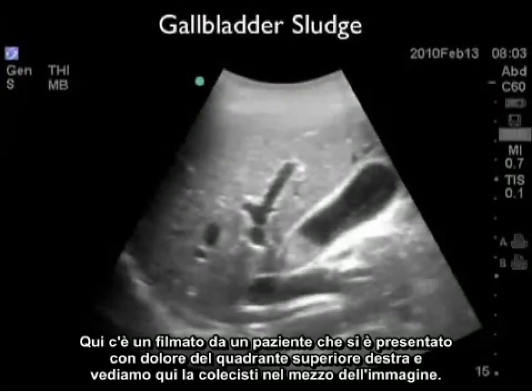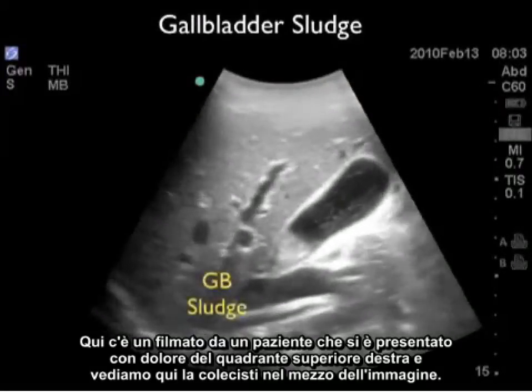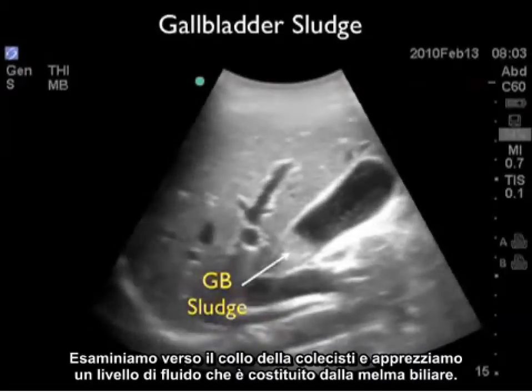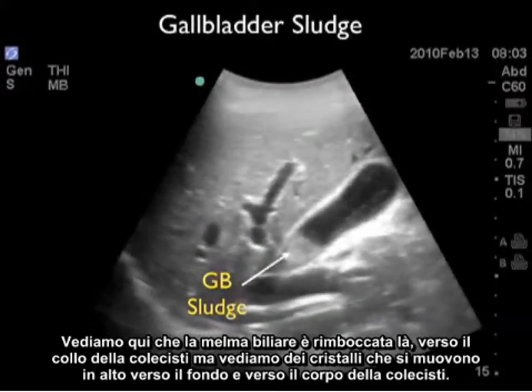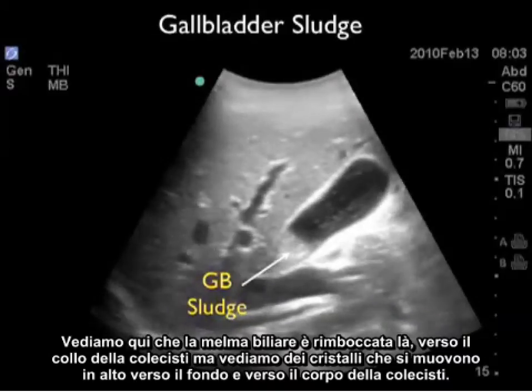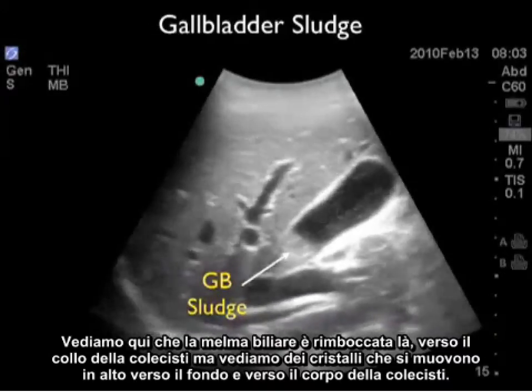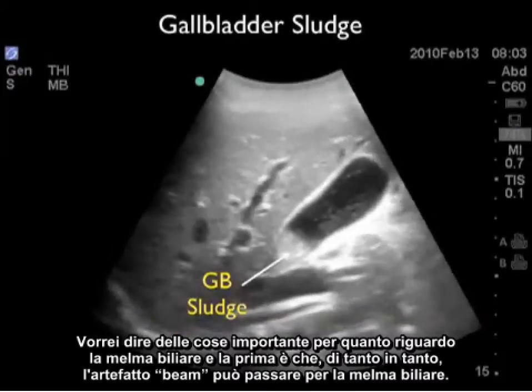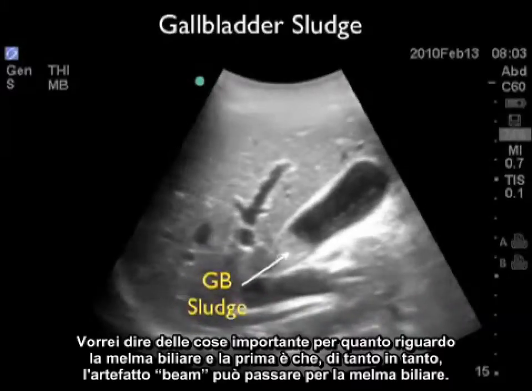Here's a video clip from a patient who presented with right upper quadrant pain. We see the gallbladder in the middle of the image. Looking towards the neck of the gallbladder, we appreciate a fluid level made up of gallbladder sludge tucked in towards the neck, and we see crystals moving up towards the fundus and body of the gallbladder. Beam artifact can occasionally masquerade as gallbladder sludge.